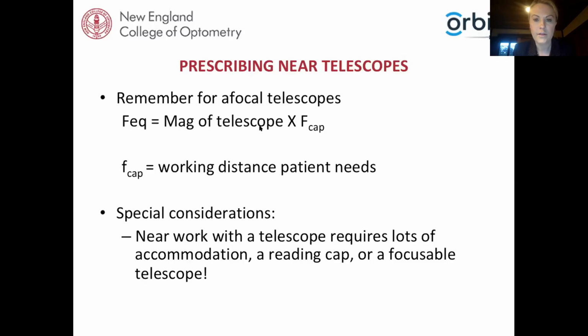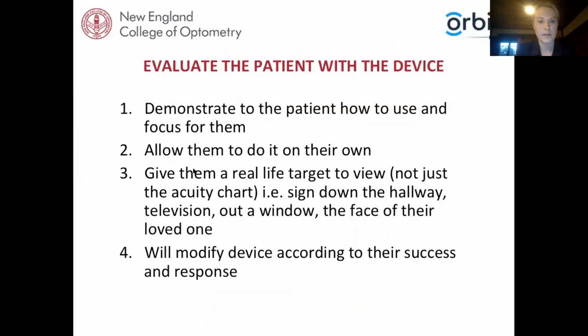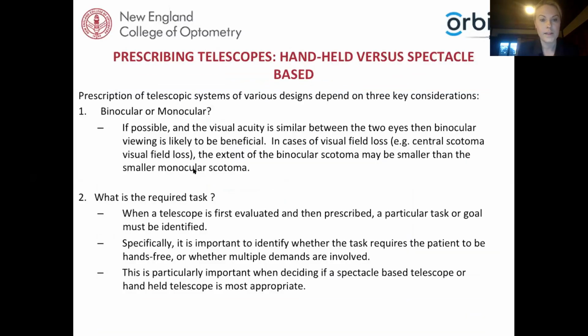In terms of prescribing telescopes, kind of going into a bit more detail, let me go back to my slides here. So the first step is to determine: do you want the patient to use both eyes or one eye? And that could depend on a number of factors.